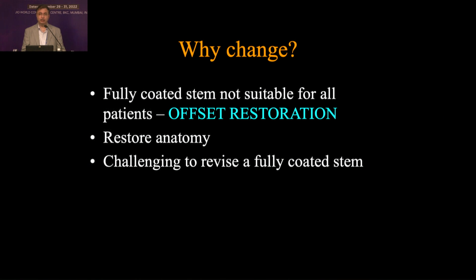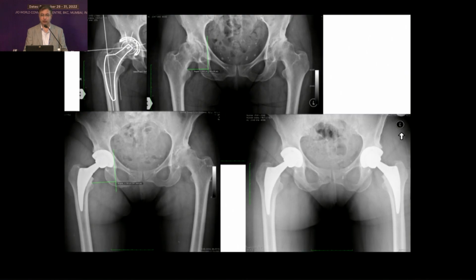A fully coated stem that's available to us may not be suitable for every single patient because the offset that it provides may not be appropriate for everybody. It may also be challenging to revise a fully coated stem when the time comes for a revision. So have a look at this particular X-ray. So there you are.